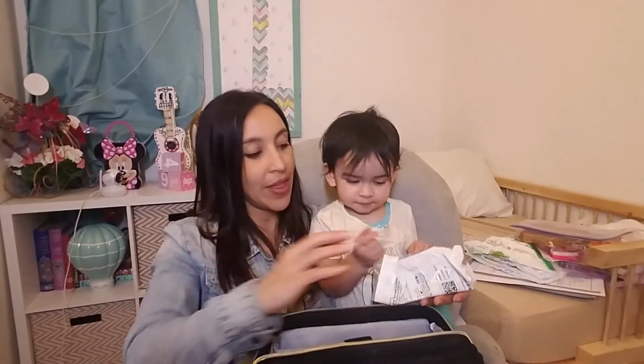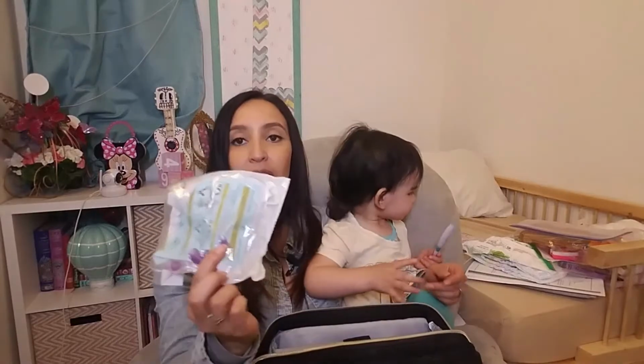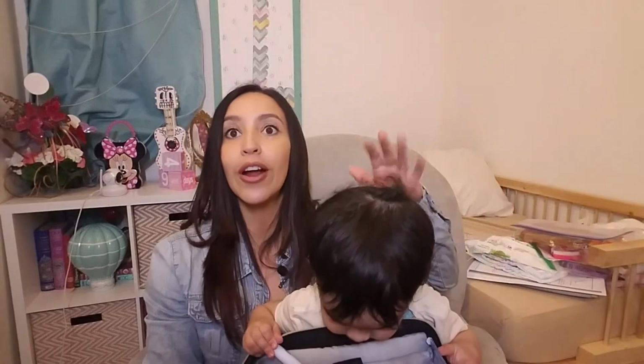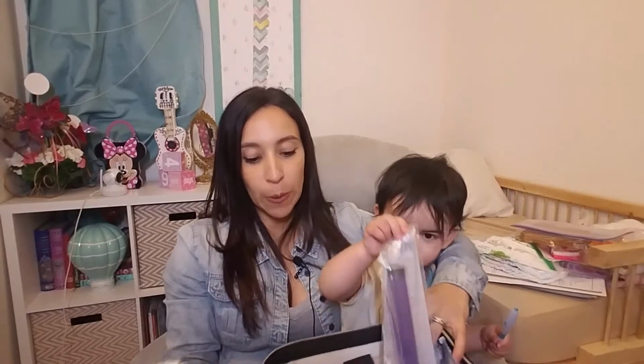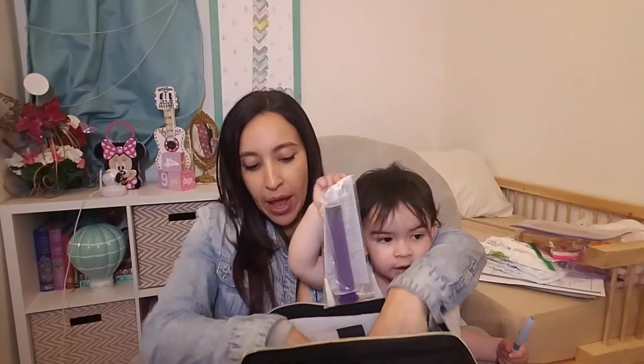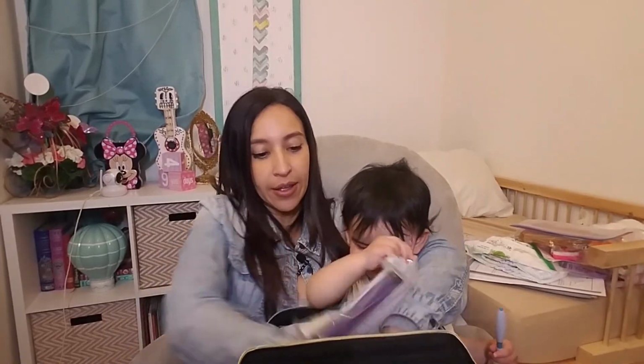Just the same thing with the Gtube bags. I always carry an extra extension too. I've forgotten the extension so many times and then I can't feed her, or I'll have to postpone it if we're somewhere far, or I'll just have to come back home if I'm somewhere local, you know, eating at my mom's or something like that. So since then I've made sure that I put an extra one in my diaper bag just in case.